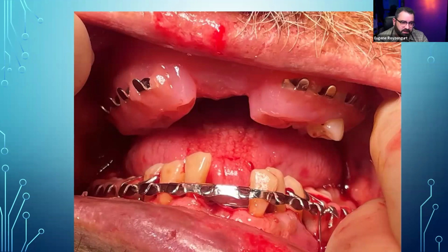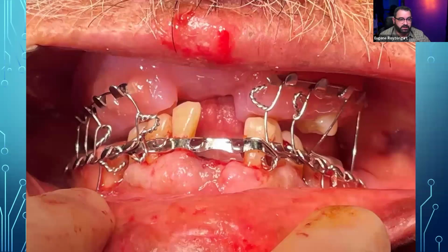them, as you can see right here, out of Pac-Dent Rodin denture base resin. And I put in these little wires in there and attached them with a little GC Tray resin. And it worked wonderfully. I mean, there was a lot of strength to it. They actually were able to drill right straight through it and screw it into the patient's palate without any fracturing or anything like that. And it worked out great, as you can see right here. So there's a lot of force being put on these things, and they still did not fracture.